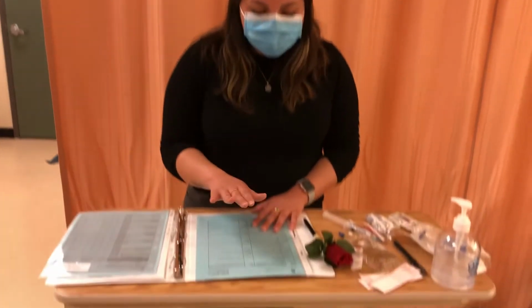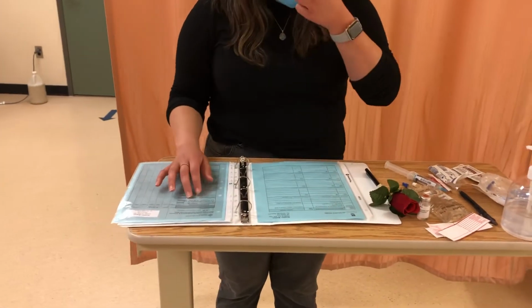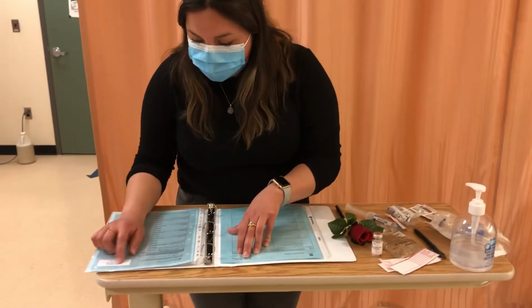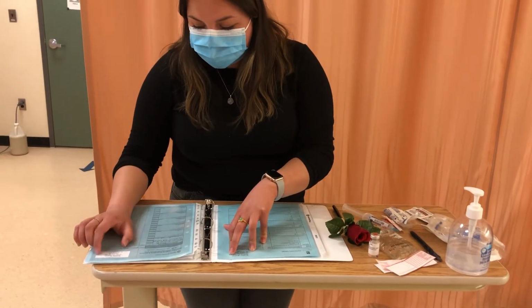So I'm going to be doing the insulin infusion continuous IV demo. I'm just going to start by checking my physician's orders and checking that it's transcribed on the MAR correctly. So here we have Bryson, Scotland, Finn 1, 2, 3, 4, 5, 6, 7, 8, 9.